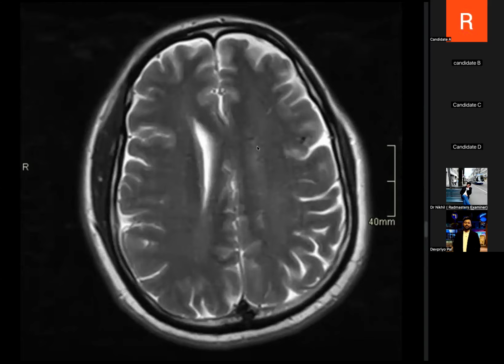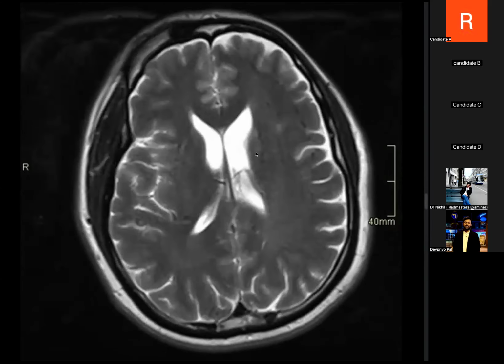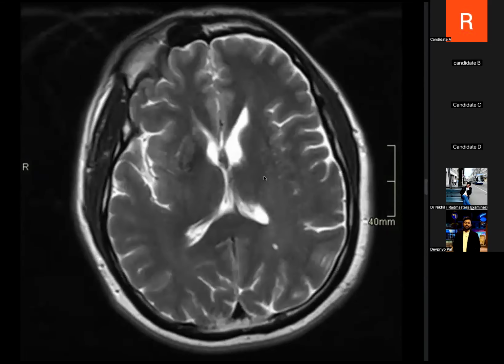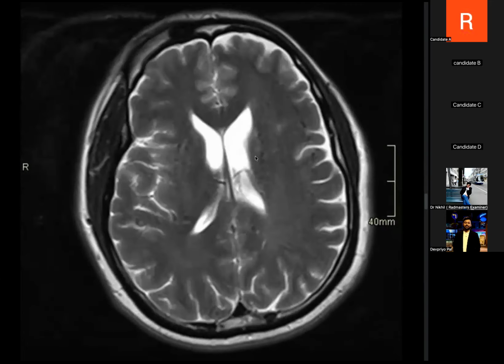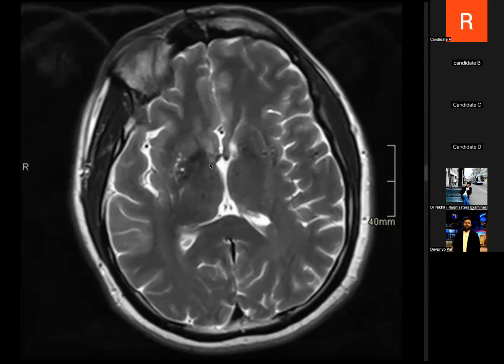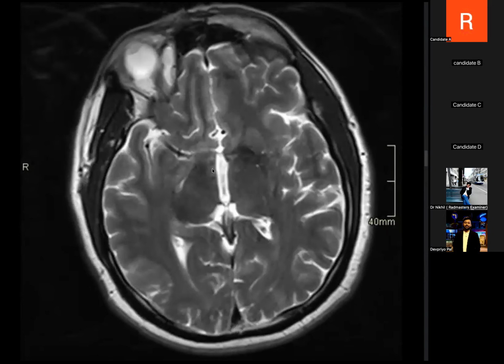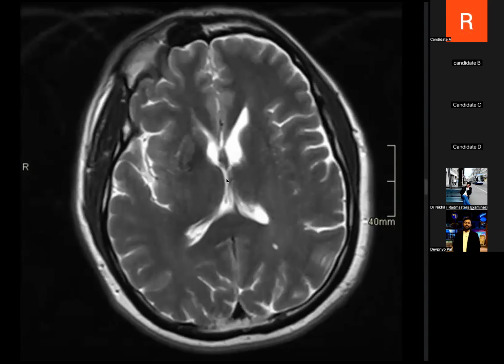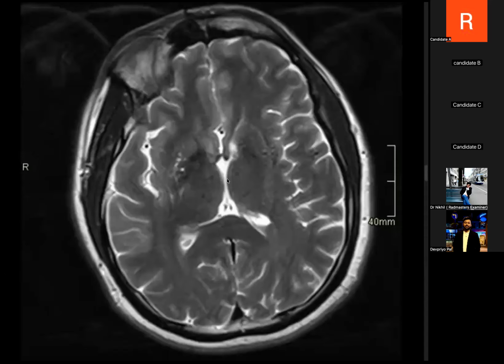Yes. This is the body of the caudate nucleus, and this is the head of the caudate nucleus. Where exactly is the head? Adjacent to the frontal horns. Okay. This area. You think it's normal? I think it is hypointense on these T2 weighted images. Okay. It usually shows hyperintensity. Okay.